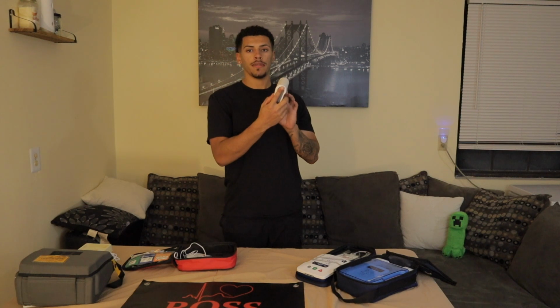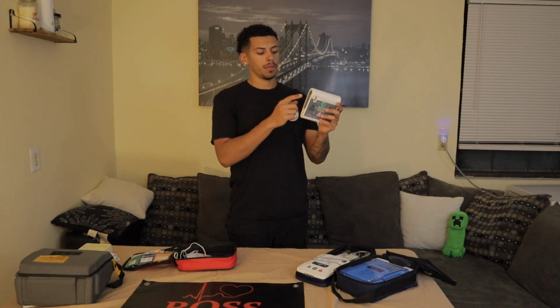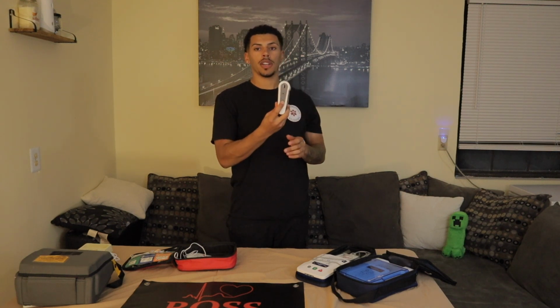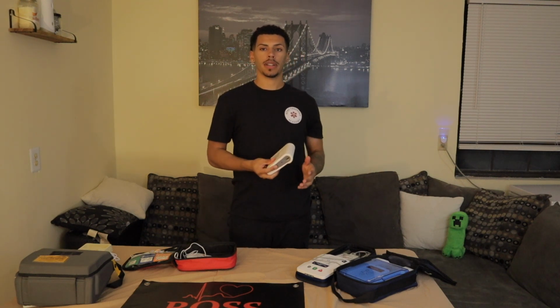Over on this side, we have a volume switch. And then we also have a place to plug in a 12-volt power source, just to have constant power so we don't rely on the batteries. And then we have an audio output, just so we can connect this, if you wanted to, to your headphones, but two speakers if you're at a large event.